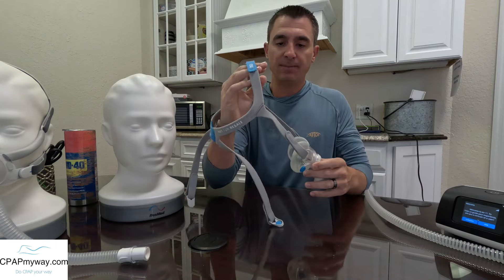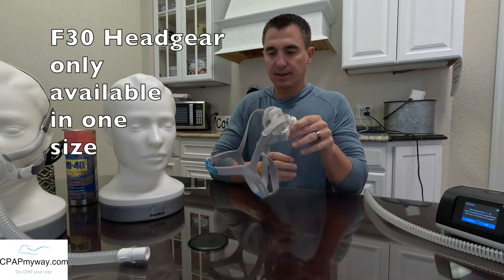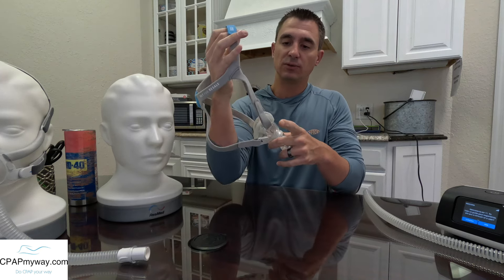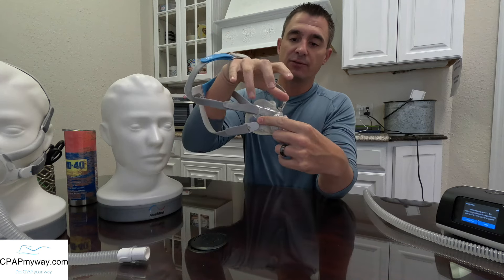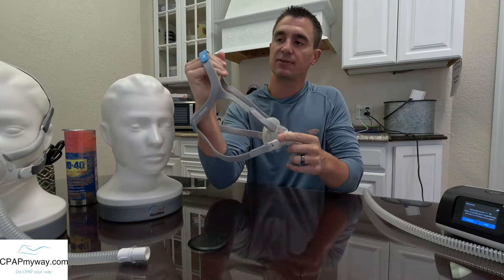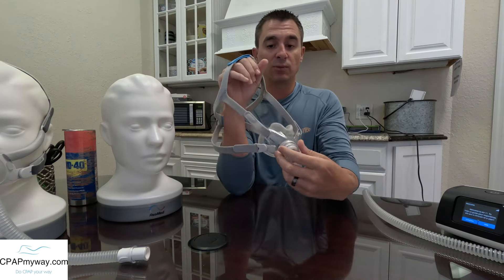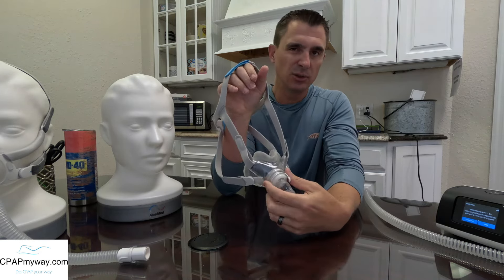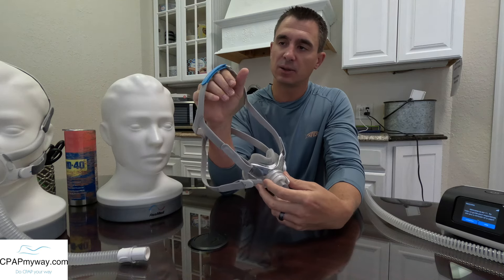The headgear on the F30 has five points of adjustment. You've got four points — two on each side, one at the top, one at the bottom — all connecting directly into the frame of the F30, close to the cushion. That's something I want to point out specifically on the F40 later. Additionally, you've got a top adjustment. This F30 was only one size headgear, but it did have the top adjustment which allowed you to help if you had a smaller or larger head — you could adjust it a little bit on the top.